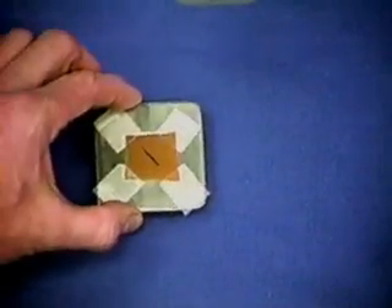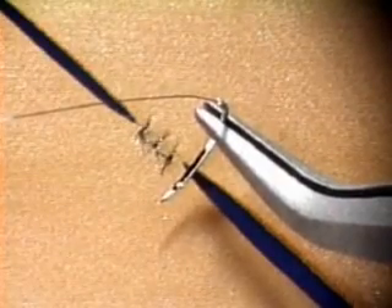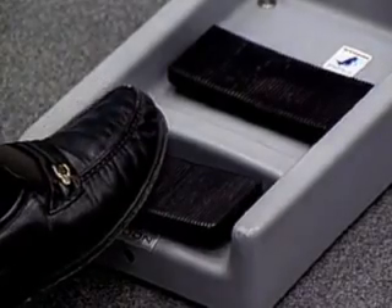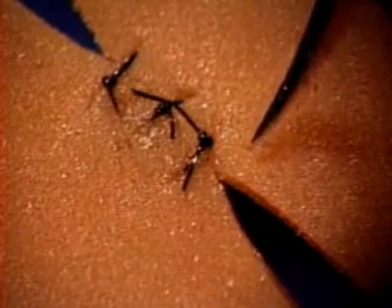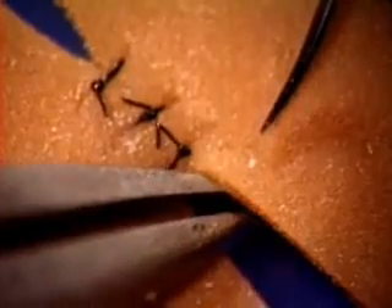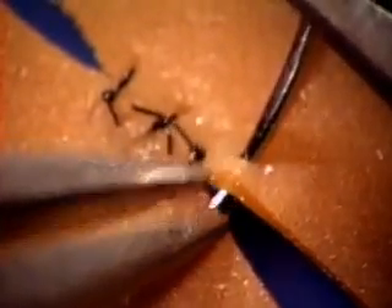Now let's look at passing the needle through the tissue. When you first begin, work in the direction that's easiest — with the needle pointing from top right to bottom left. Make sure your hands are sitting firmly on the table with fingertips supported. Put the microscope up to high magnification so you can really see what you're doing, and stay at high magnification until you've finished passing the needle. Bring in the needle and pick the spot where it's to enter — the distance between the entry point and the edge should be about equal to the thickness of the tissue. Come under the tissue edge with the left hand forceps and raise the tissue up toward the needle, everting it.